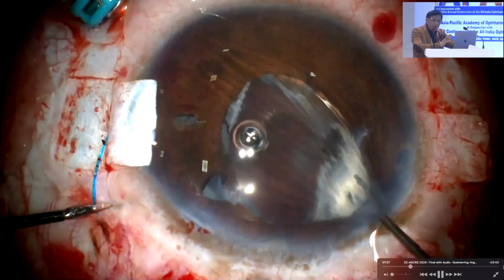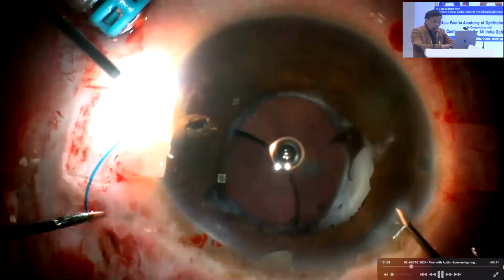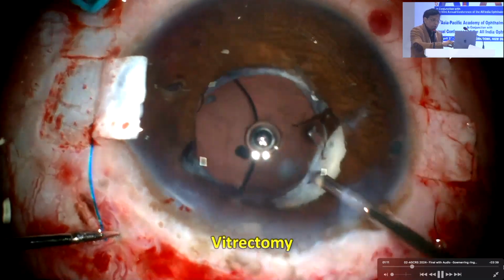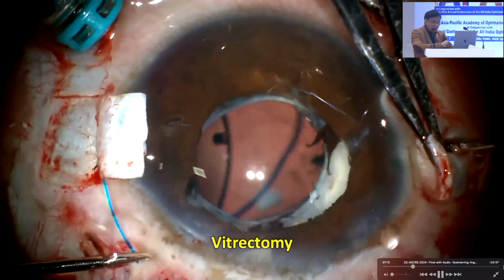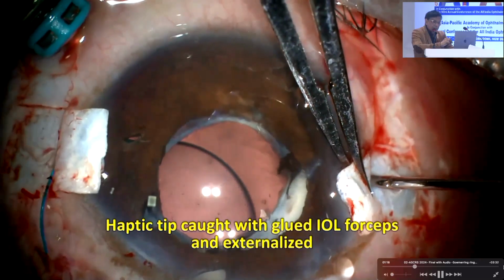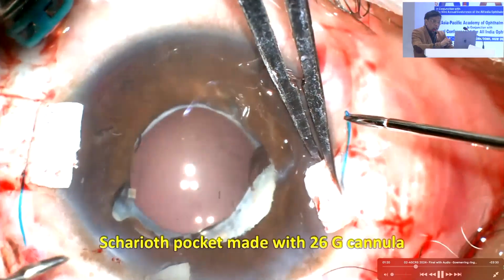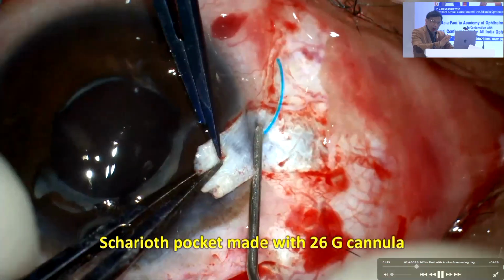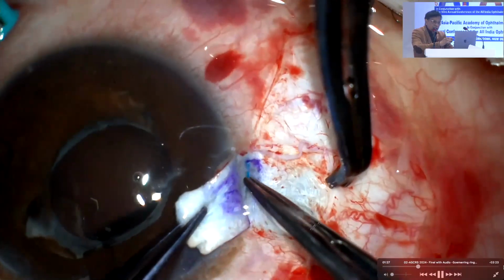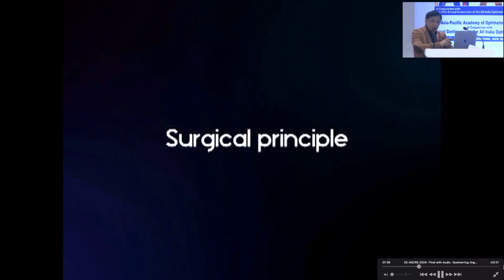So whenever you have a Soemmering ring where there is no capsule, remember, I need a scaffold there. But where will I put the scaffold? Unless you do a Yamane or a glued IOL, you can't do it, because you have to go behind the Soemmering ring. So now I'm doing the second haptic. Once I catch my second haptic, look at the tip, catch the tip and bring it out. So this is the glued IOL scaffold. Now once I have a scaffold, I'm tucking it into the Scharioth pocket. Now I can attack the Soemmering ring.